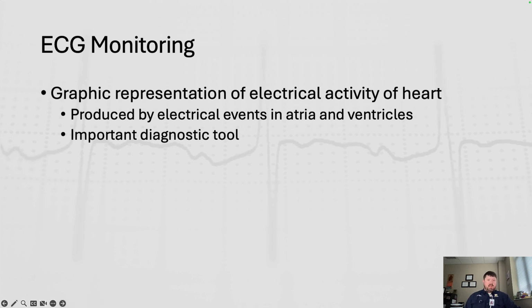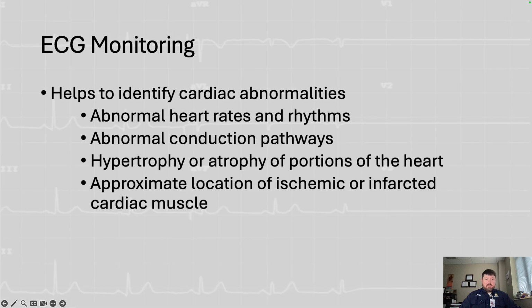This is an important diagnostic tool, and one of the things that you always hear people say is treat the patient and not the monitor. And that is true to an extent, but you've got to use not only your diagnostic tools, which include your cardiac monitor, but you've got to use your assessment tools as well. And my saying is, treat the patient, not the monitor. But if the monitor matches what the patient's showing you, then treat the monitor, because the monitor is there to help you figure out what's going on with your patient.